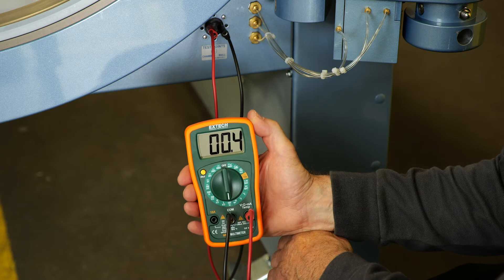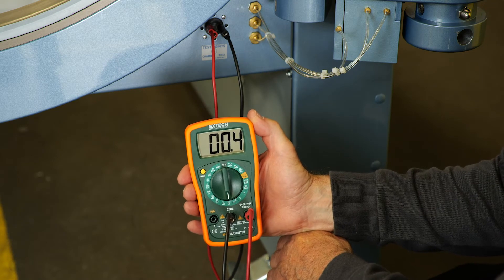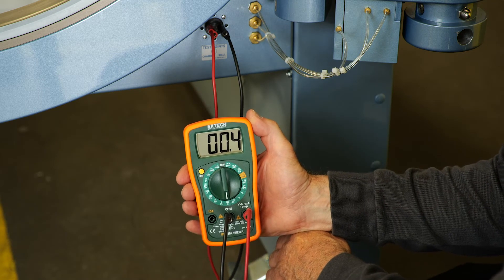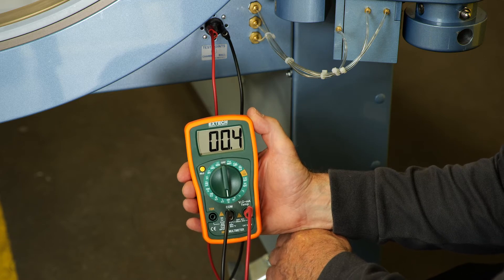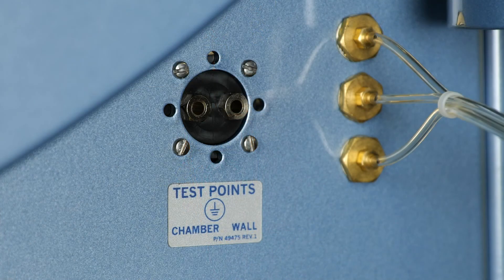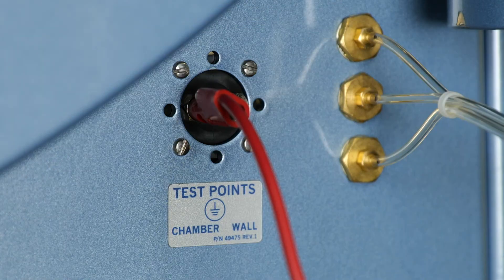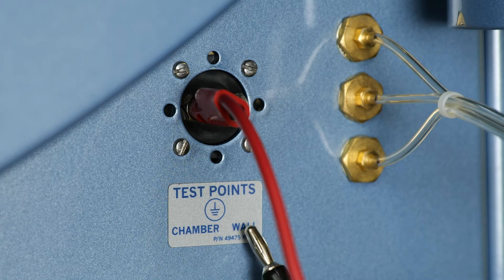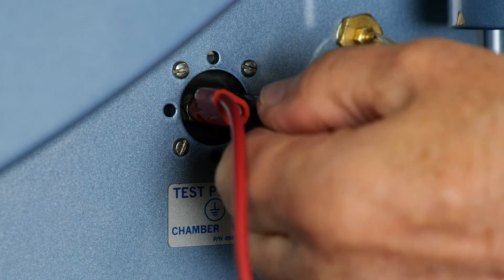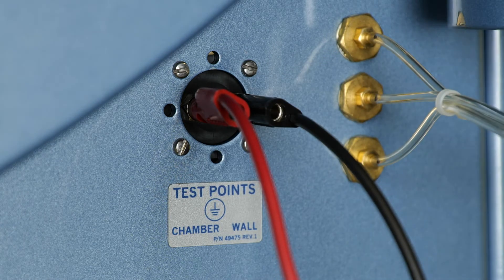To check the chamber ground on a chamber with the Seacrest grounding kit, you take the red and black leads and plug them into the common and ohm support on the meter. The red lead then goes to the chamber port on the chamber test point, and the black lead goes to the wall port on the chamber test point.